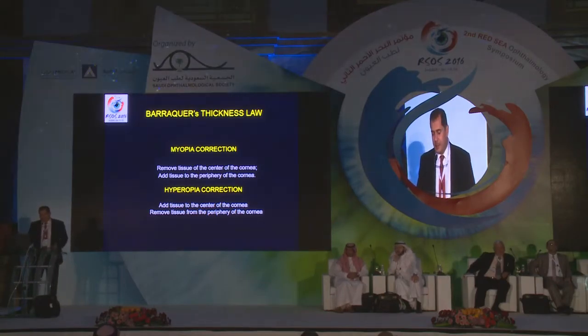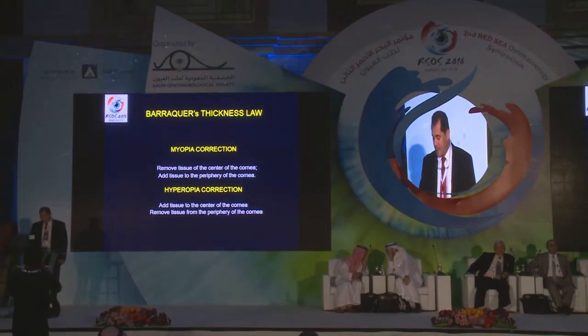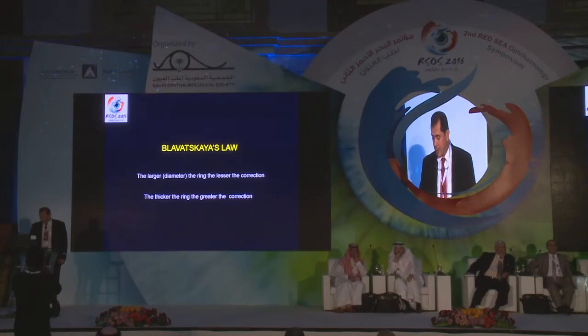The idea is based, as everybody knows, on Barraquer's thickness law: for myopia correction, remove tissue from the center of the cornea and add tissue to the periphery of the cornea. For hyperopia correction, add tissue to the center of the cornea and remove tissue from the periphery. And by Blavatskaya's law, the larger the diameter of the ring, the lesser the correction; the thicker the ring, the greater the correction.